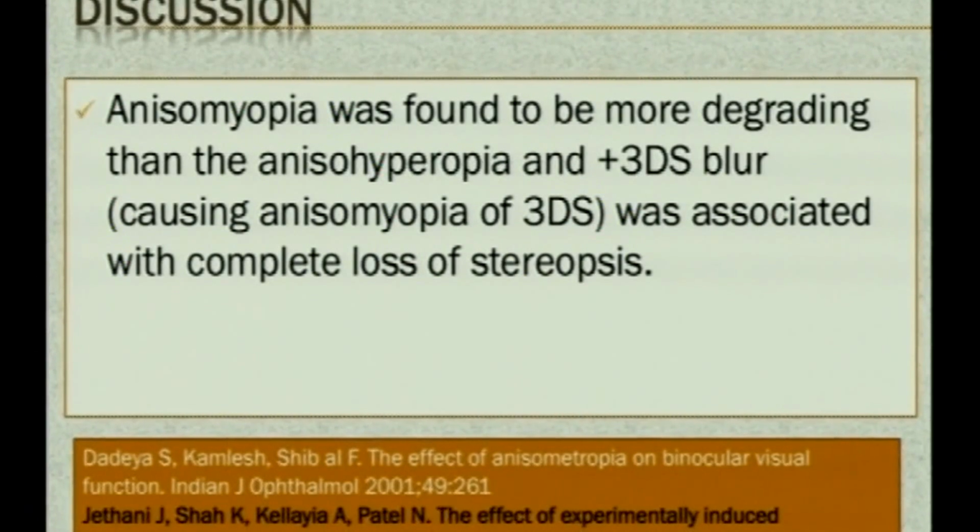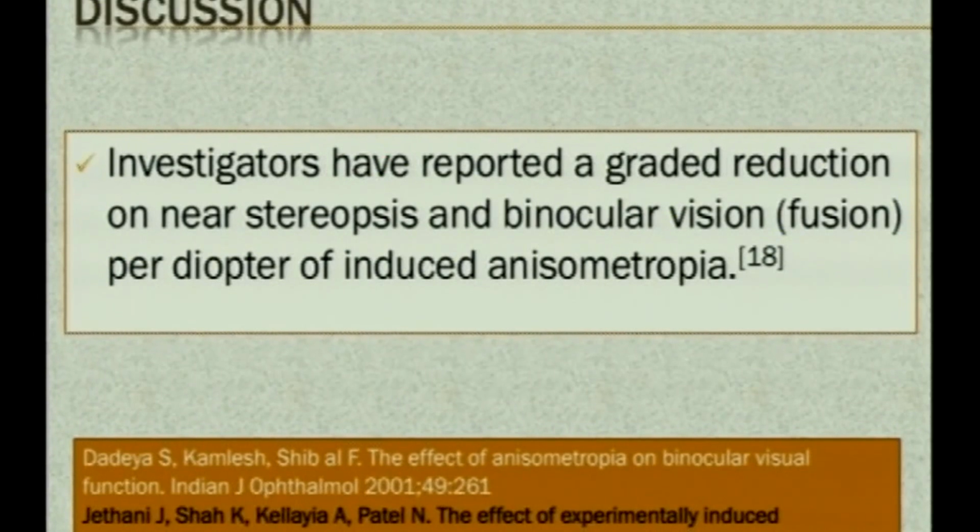Anisomyopia in previous studies was found to be more degrading than anisohypermetropia. That's why we used anisomyopia. Plus, it has clinical applications. And 3 diopters of blur was certainly not compatible with distance stereopsis. So one should not be creating such kinds of situations.